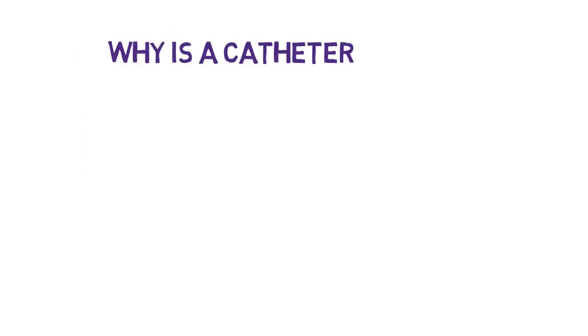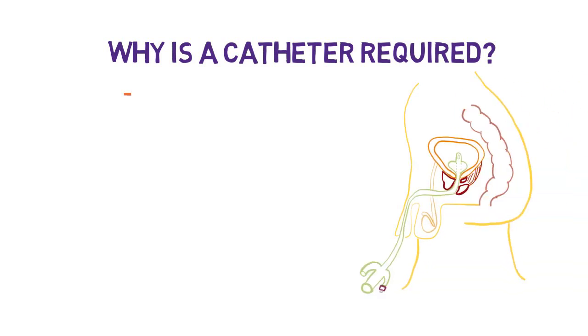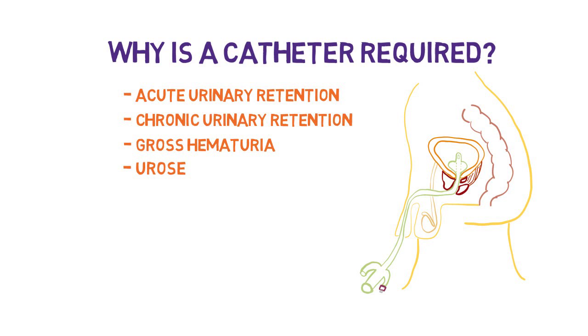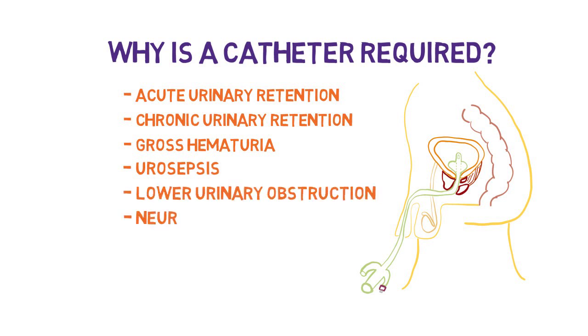Why do some patients require a catheter? There are many different reasons, including acute urinary retention, chronic urinary retention, gross hematuria, urosepsis, lower urinary obstruction, neurogenic bladder, surgery, and the need for accurate fluid balance.